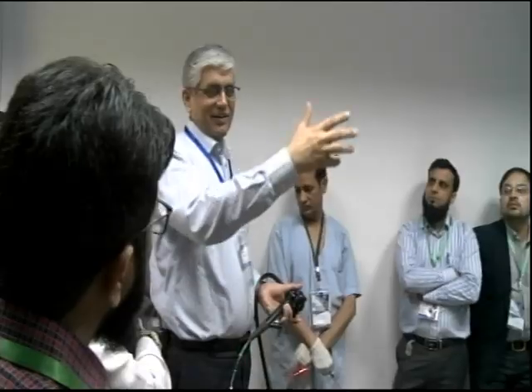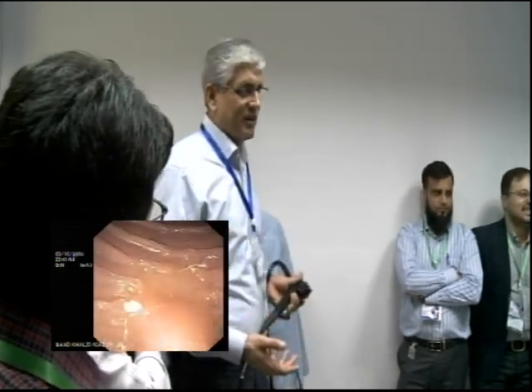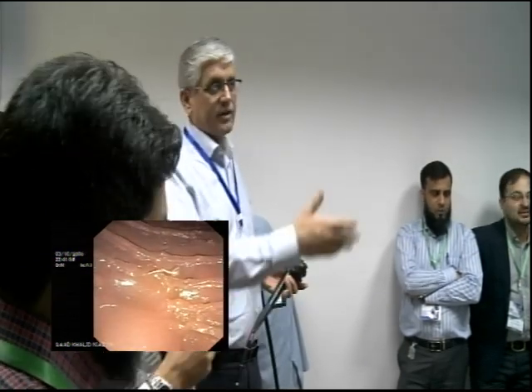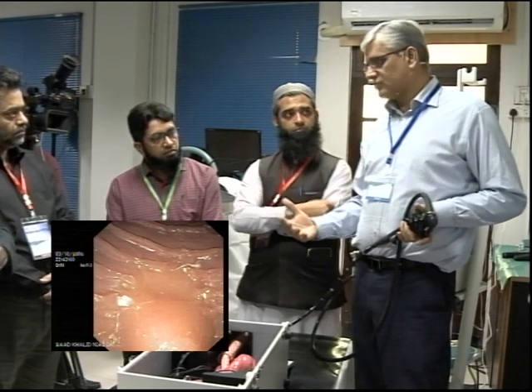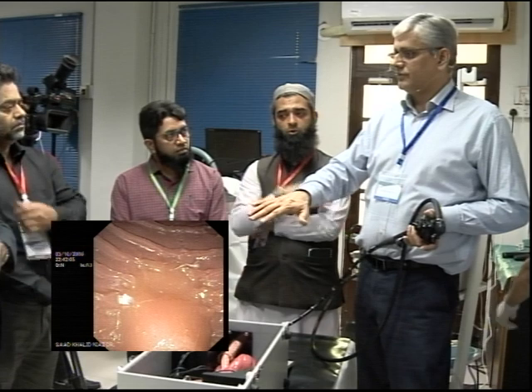Early days, what he's talking about is that it's irritating not to be able to use the big wheel. Our habit is such that if it's not like this, we'll say, what's wrong? If you hand it to me like this, immediately you think, what is this? Yeah, why have you locked it? So that comes with experience, and maneuverability is important, and he does difficult cases. But in your early days, there is no harm if you lock it.